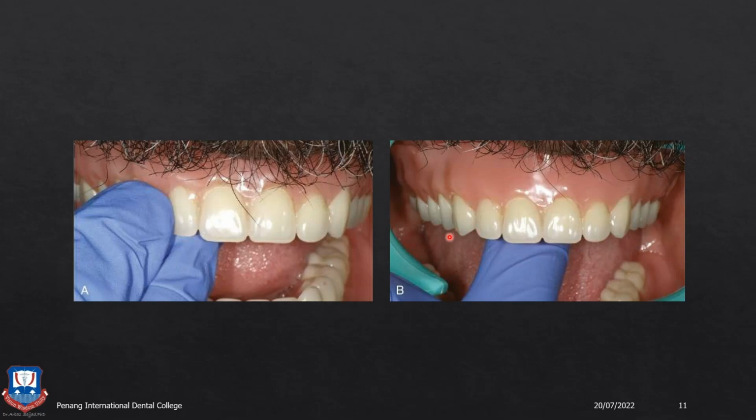If you tip the canine towards the right side, then on the left contralateral side, the pterygomandibular raphe and the hamular notch should have been recorded properly and the denture extension should be accurate.